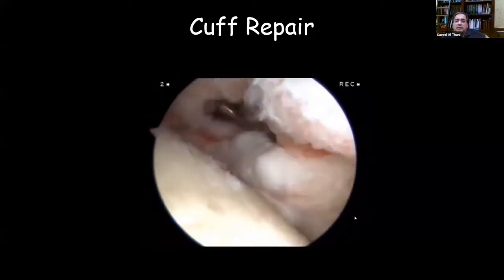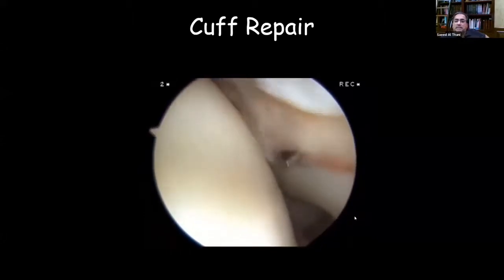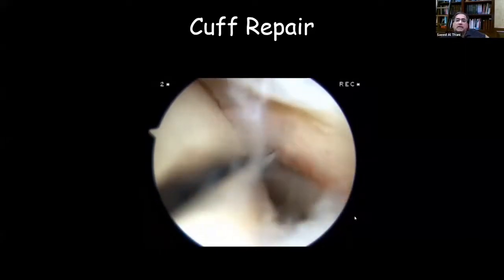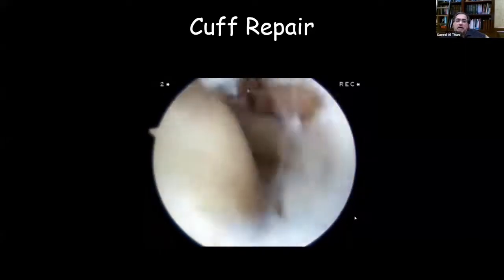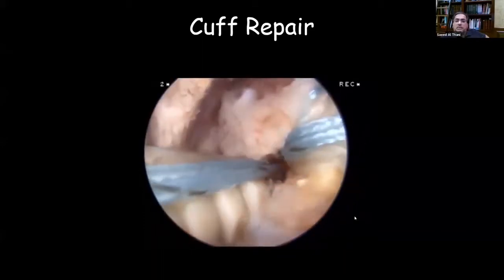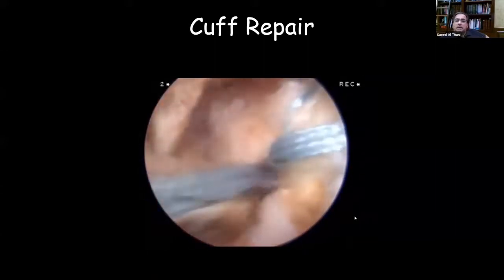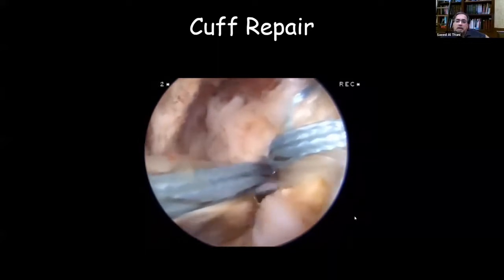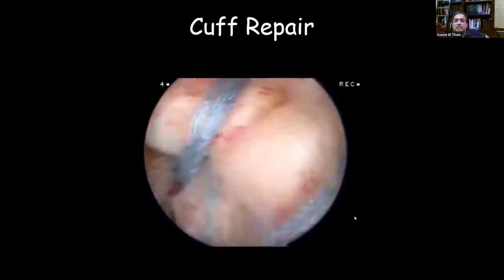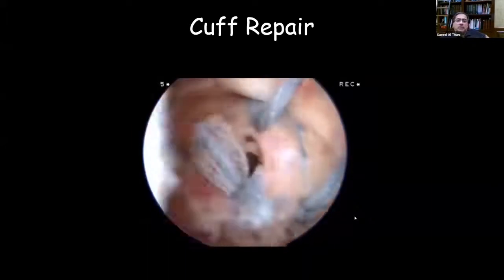And here I switch to the glenohumeral scope from inside just to make sure that I don't take the biceps tendon with me when I try to repair, and I have to take the full thickness here. I usually use a suture lasso to pass the suture exactly where I want. After we pass, we tie it medially, and this is the lateral anchor here. So just a routine. And you can see here, we did this cuff repair in full.